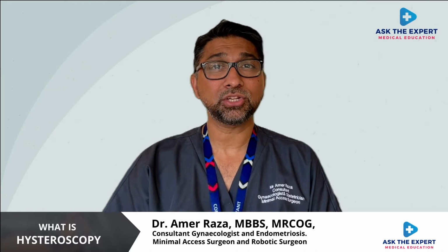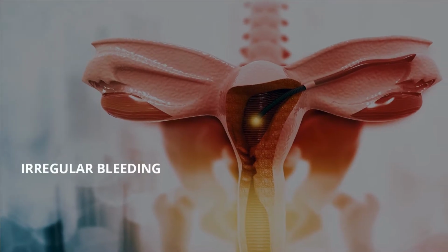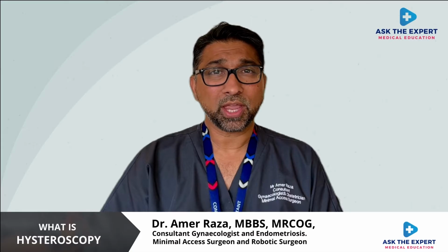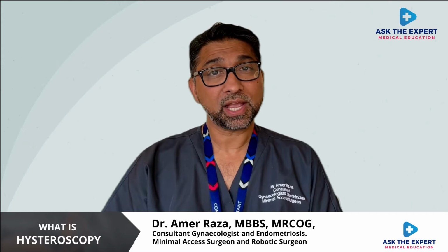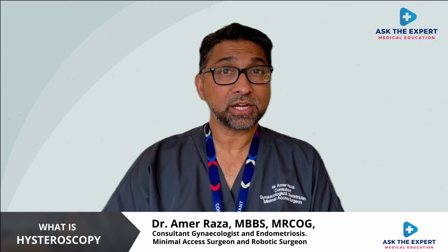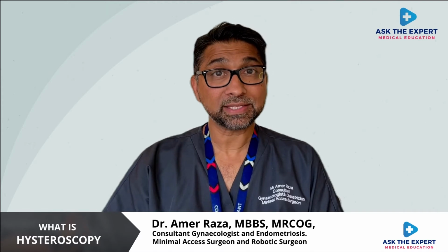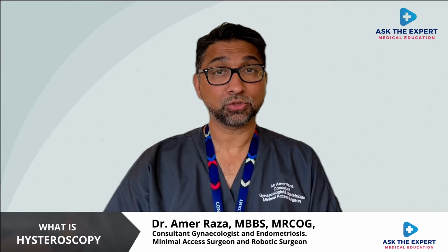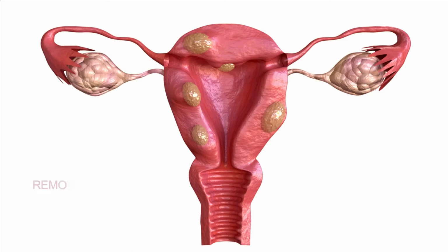The diagnostic indications for hysteroscopy are to investigate irregular bleeding, postmenopausal bleeding, to check for endometrial polyps, to do fertility assessments, and also to check for fibroids as a pre-operative assessment. Hysteroscopy is also carried out if threads of the coil are lost and as a part of our cancer diagnostic work.